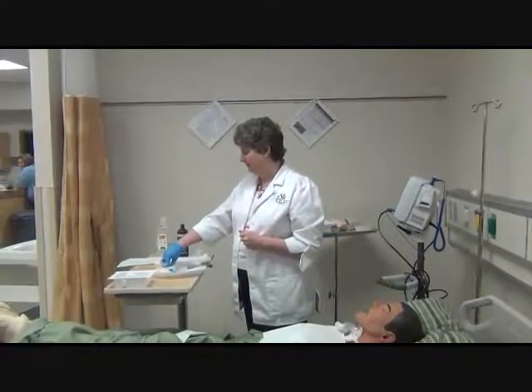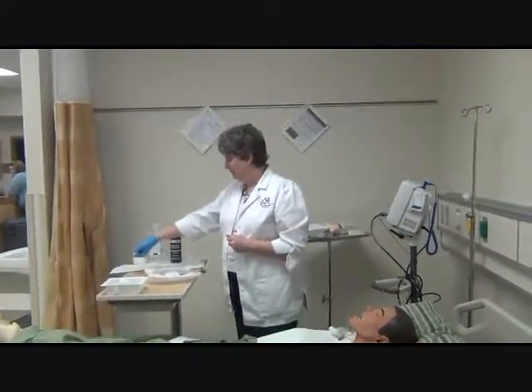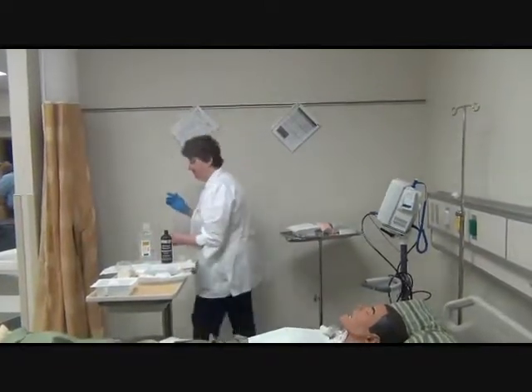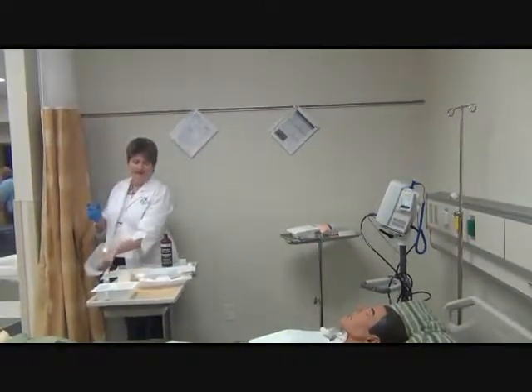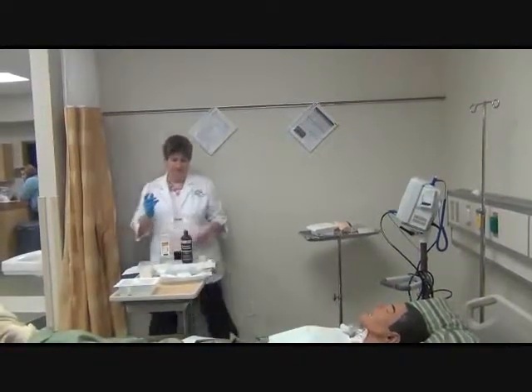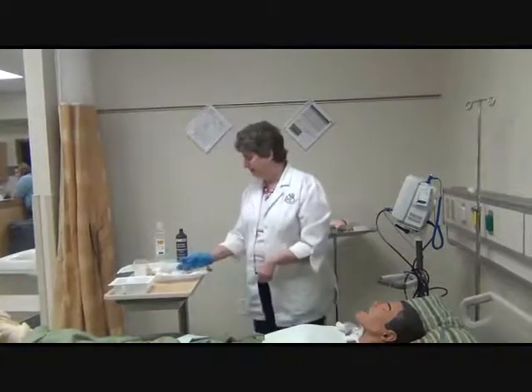I'm now going to pour my saline into my package, and that's going to become my irrigation.